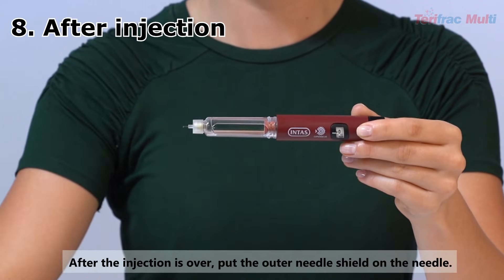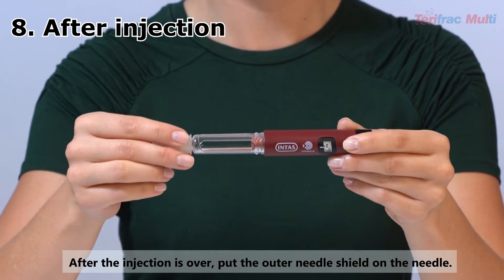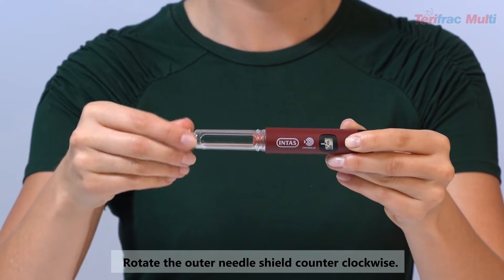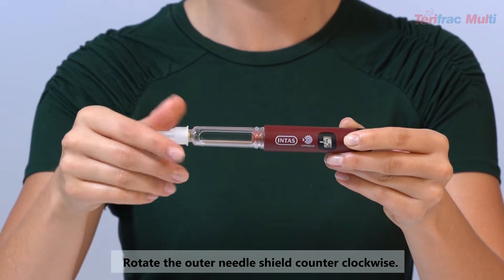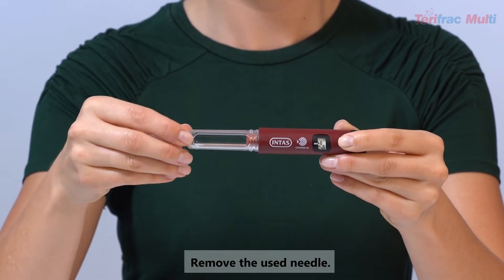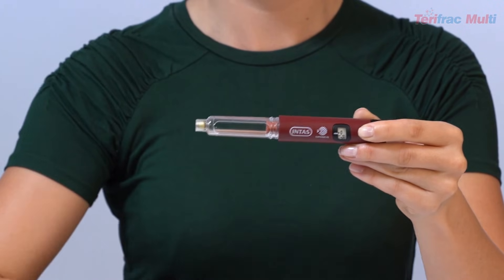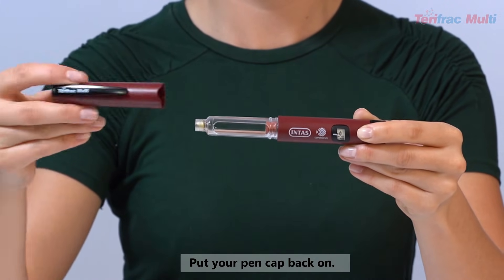After injection: After the injection is over, put the outer needle shield on the needle and rotate the outer needle shield counter-clockwise to remove the used needle. Put your pen cap back on. You have completed your Teriparatide injection.